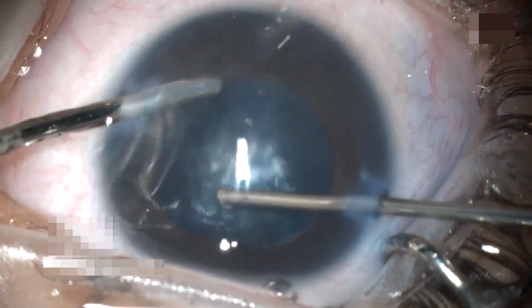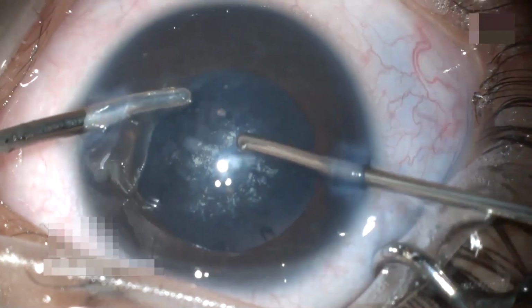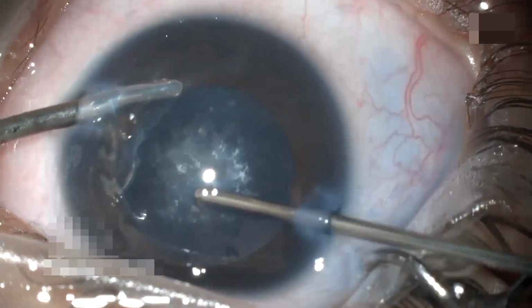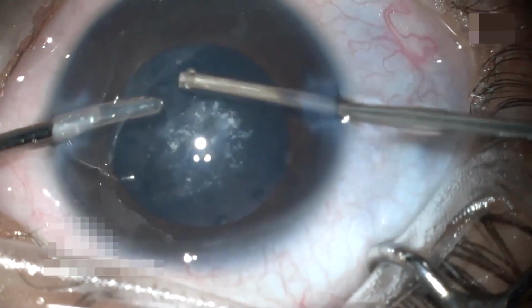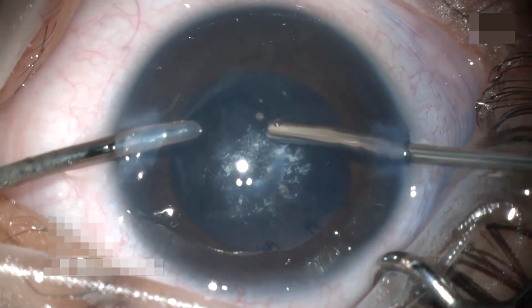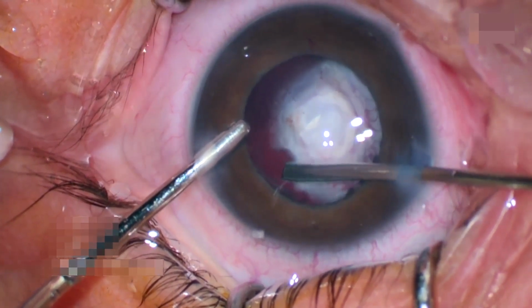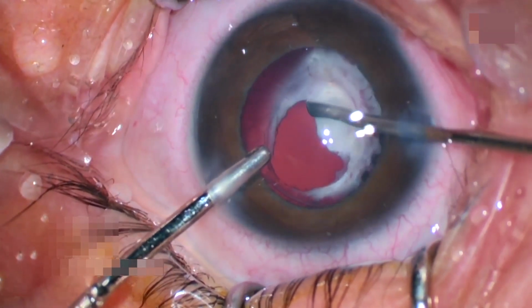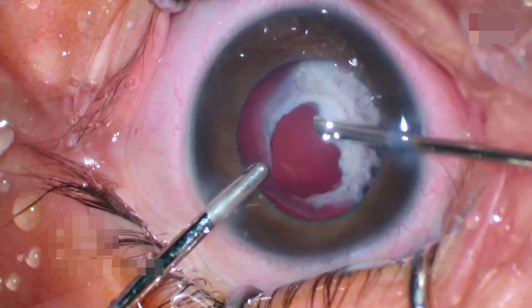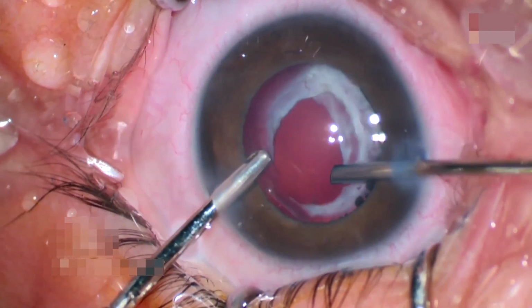The Vitrector cut capsulectomy is a substitute to capsulorhexis performed by a rhexis forceps in situations such as crumpled anterior capsule in long-standing cataract, fibrotic anterior capsule, subluxated lens, traumatic cataract, and in membranous cataract. Capsulectomy using a vitrector is achieved by a high flow rate and a slow cut rate, and the cutting port faces the edge of the capsule and is enlarged in a spiral manner. This is called Vitrectorhexis.